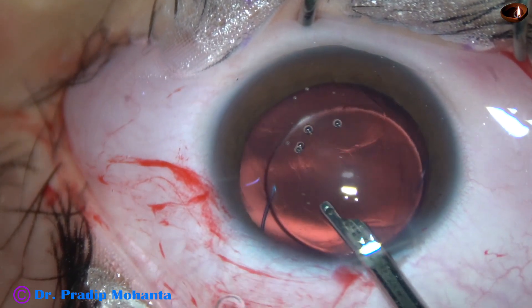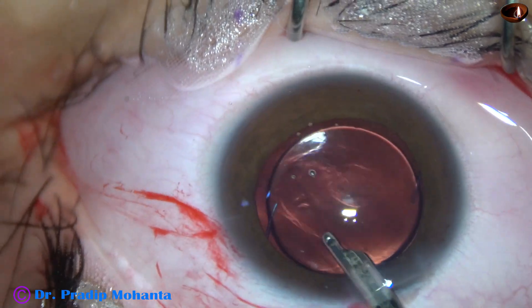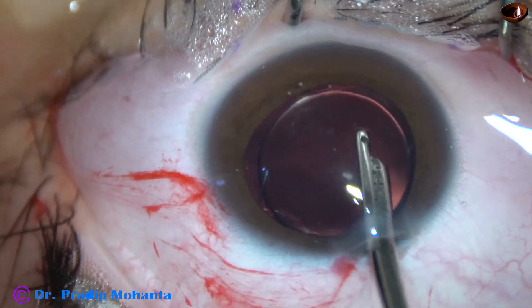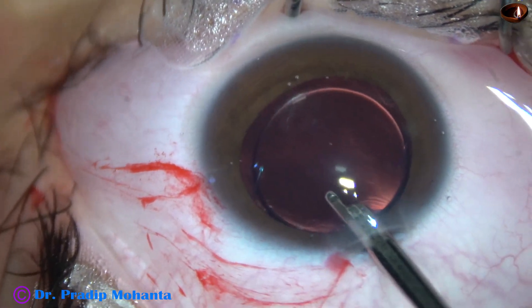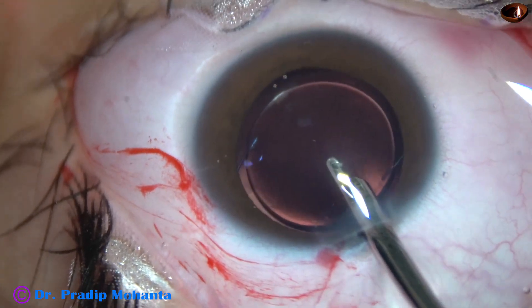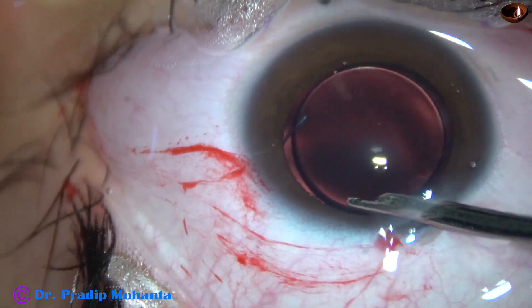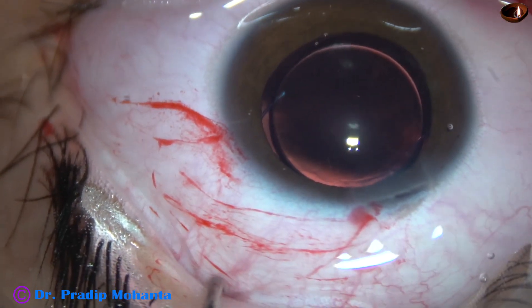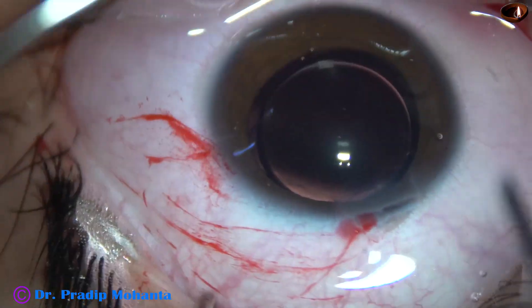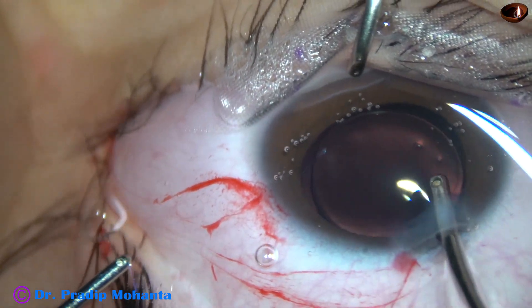Now we have to clean the viscoelastic very nicely. We have explained to the patient that clear lens extraction and intraocular lens implantation will rob her of accommodative power — she will not be able to accommodate. We suggested either a phakic IOL, which she could not afford, or we told her we will keep this eye at minus 1.5 diopters myopic and she will be able to do most work without any spectacles.